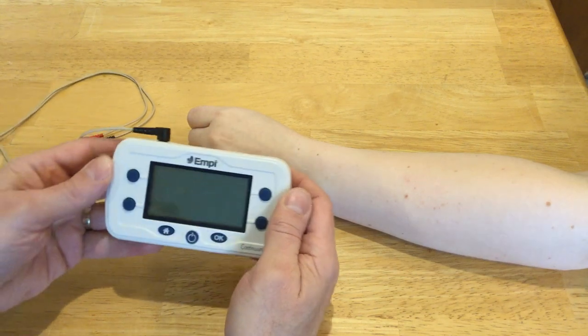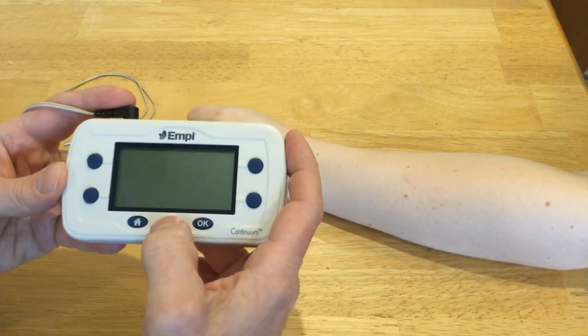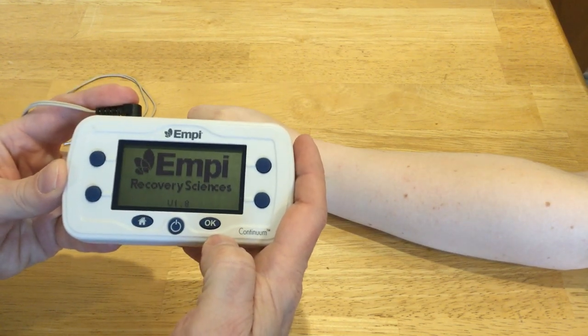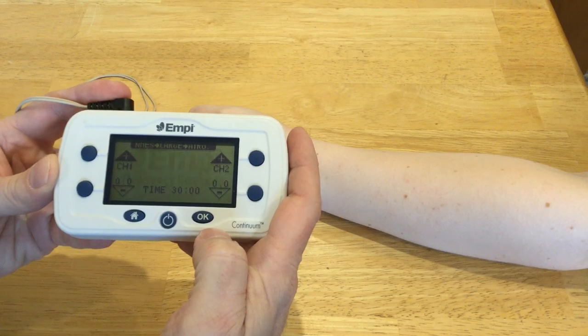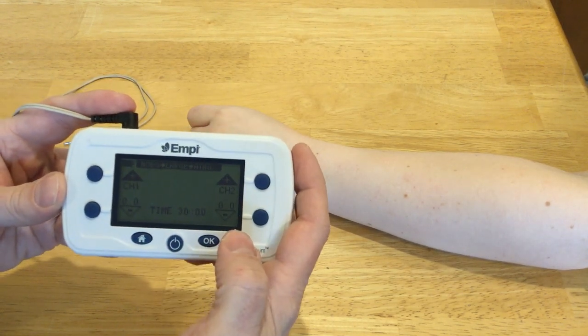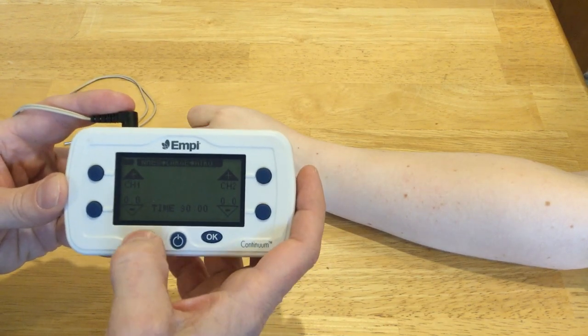First I just want to show you the unit and how some of the settings are done. First thing I'm going to do is turn it on. You'll see this is still set up with some other settings from whoever used it last, so I'm going to push the home button.